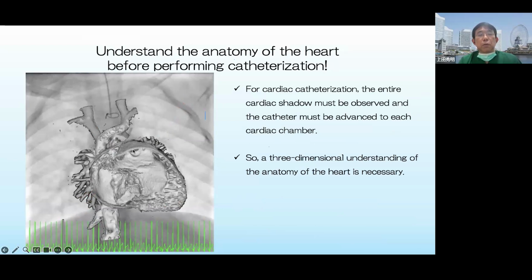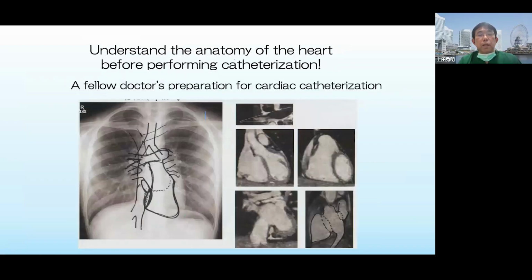But it should not be done so frequently. So if you are able to do a CT scan, something like this, and then you trace or look at this X-ray and see where the aortic valve is and where the pulmonary veins are, maybe you can try to imagine where the left atrium is and how the pulmonary arteries are located.